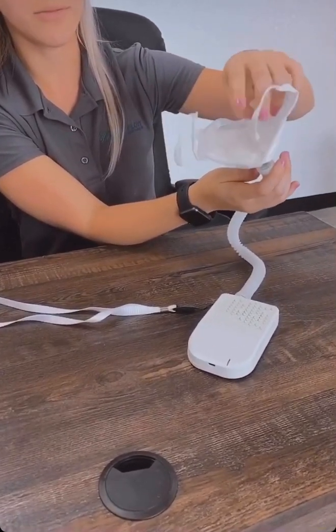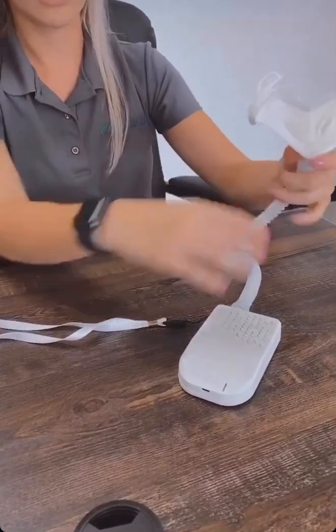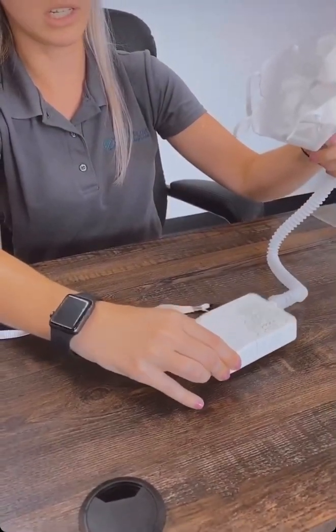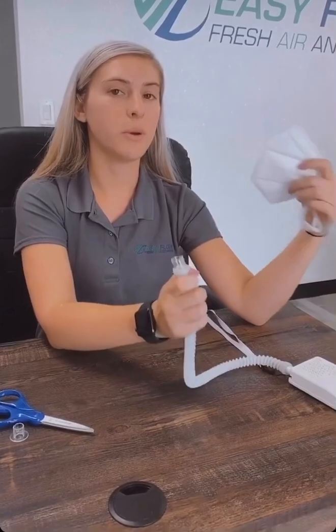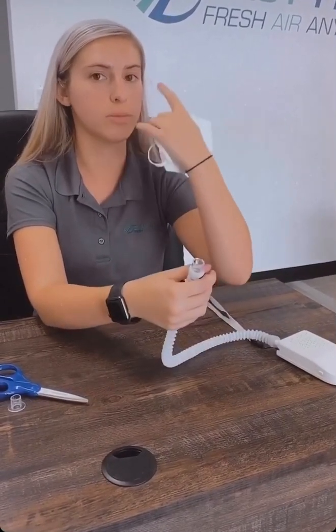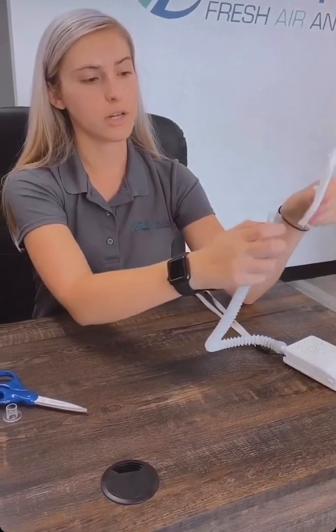And even if there happens to be some holes in it, this positive flow of the EasyFlow device pushes out all that unfiltered air. So first you want to decide, where do you want the airflow? Most people want it between their nose and their mouth, so they're not getting too much air in either area. So that's right about there.